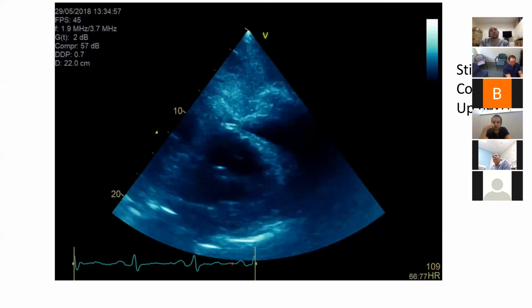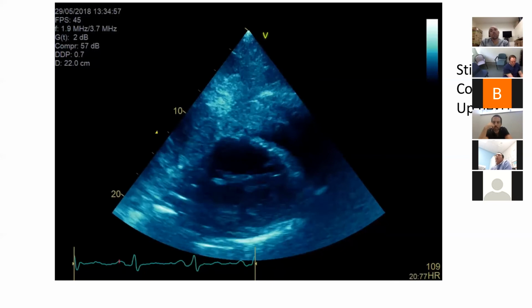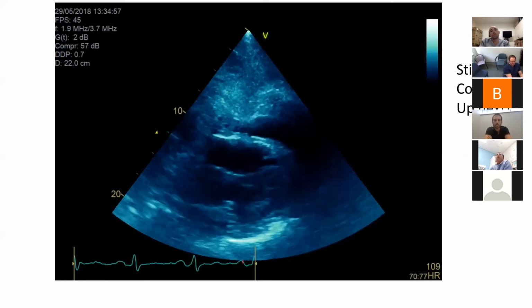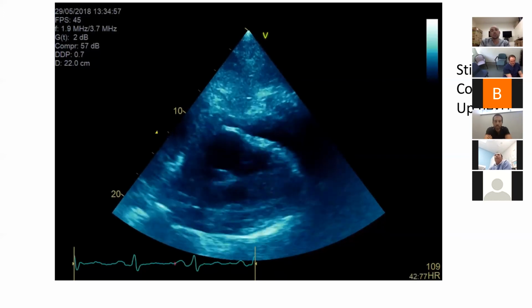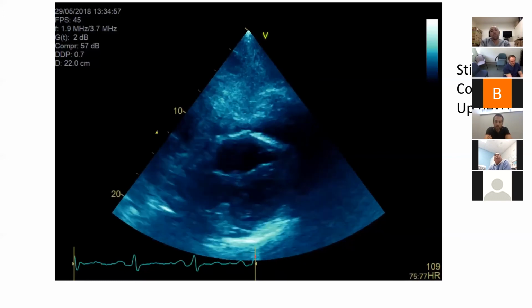Based on the respiratory variation and the pericardial fluid, and the fact that even if you do have something compressing it, there's something else going on, I think you drain this effusion, right? No, the question is, in context, this patient came after this hemangioma. Oh, absolutely. I agree there might be a structure there, but does it change what you're about to do next is my question. No.